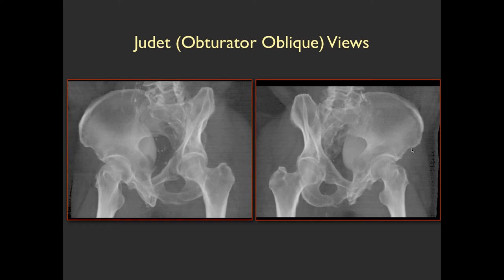These are virtual Judet views created from CT volume rendering. On the right posterior oblique, you see the ilium going down to the ischium — that's the posterior column. On the left side of the same view, you see the anterior column. Surgeons like to get these both with plain radiographs in five-view pelvis studies for initial diagnosis and follow-up. The main benefit is not so much to detect fractures as to assess fracture alignment and overall pelvic stability over time.